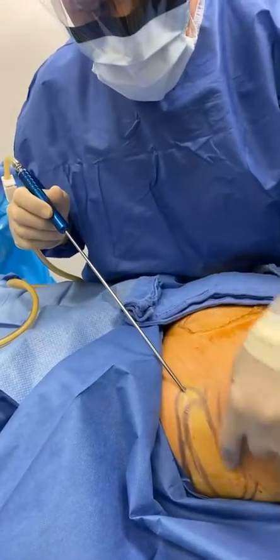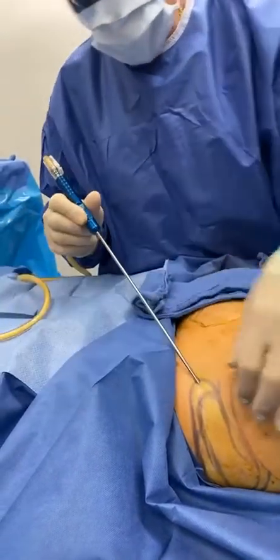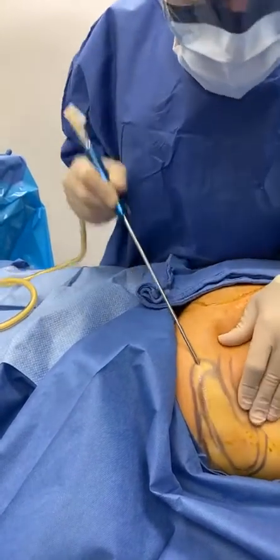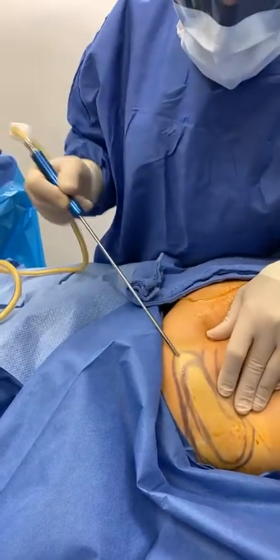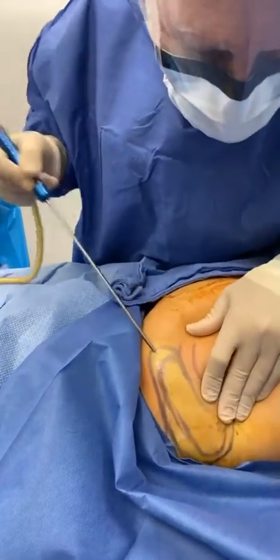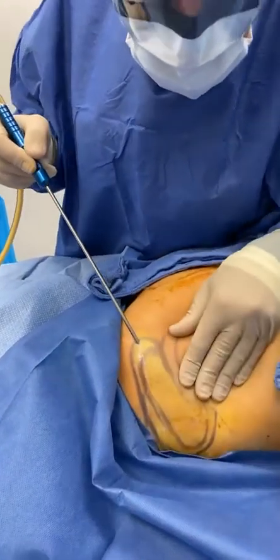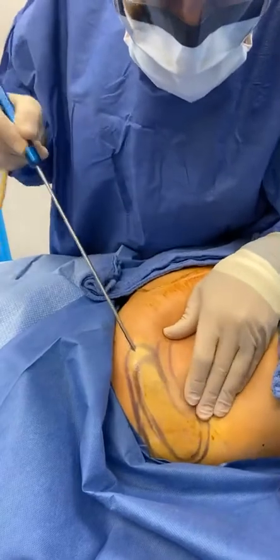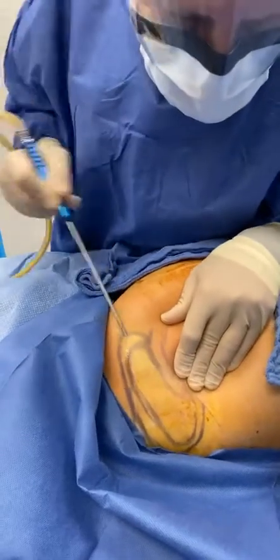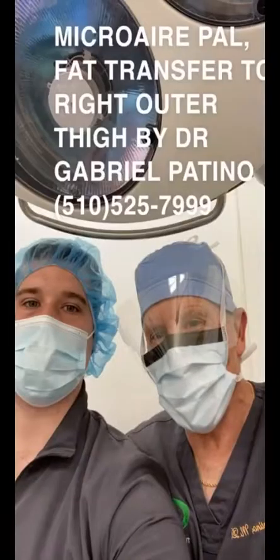This lady is concerned about a depression she has there. Look at the beautiful fat — not a drop of blood. So what we're doing is going ahead and infiltrating this fat into this area. It's a little depression in the outer thigh — not much. She likes her buttocks, but this is the outer thigh area, just outside the gluteal crease. We're putting the fat in there into the outer thigh area.